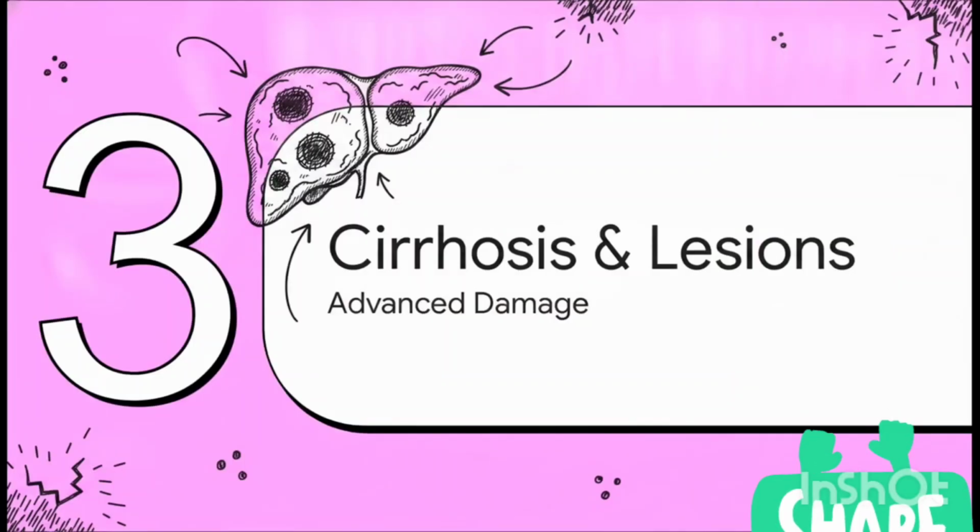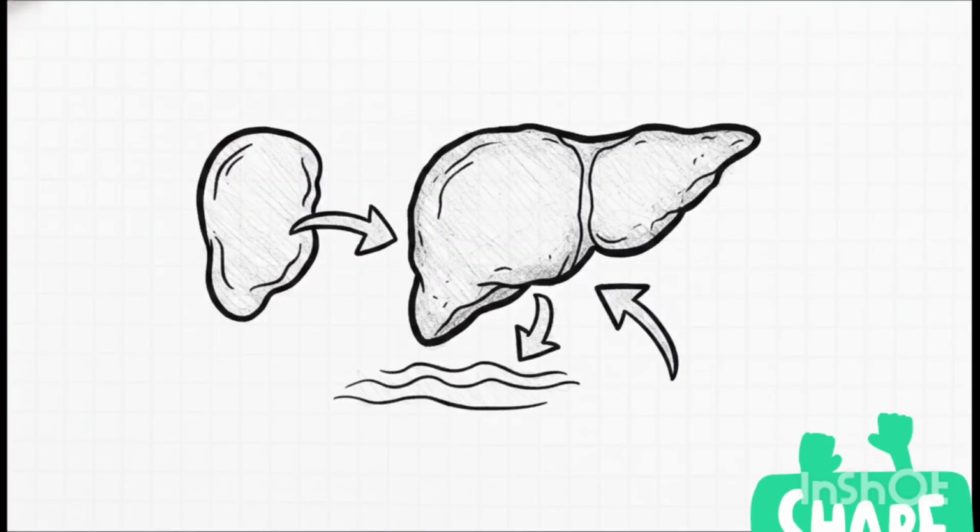Section 3. Cirrhosis and focal lesions. All right, we are now transitioning away from the widespread brightness of fatty liver and getting into more severe, advanced structural damage. When a liver progresses to cirrhosis, the visual story changes pretty dramatically. That uniform, smooth canvas, it's completely gone. Instead, you're hit with a really coarse echo texture. The liver looks rough, it looks nodular, and clearly damaged. Those beautifully smooth margins we saw back in the baseline become totally irregular and bumpy.